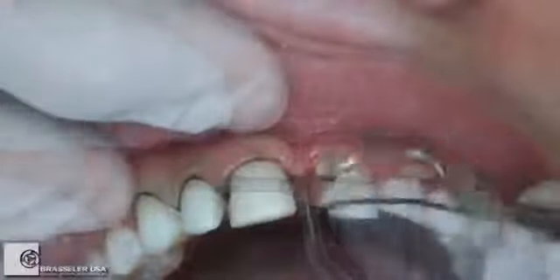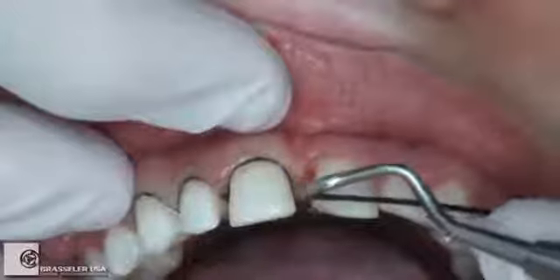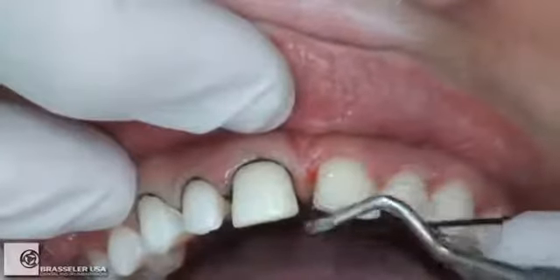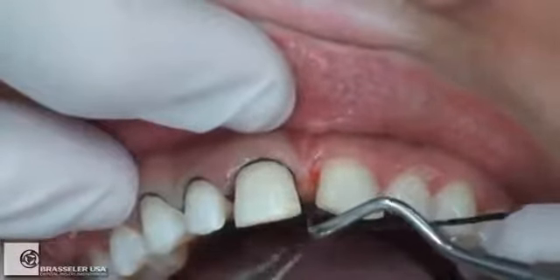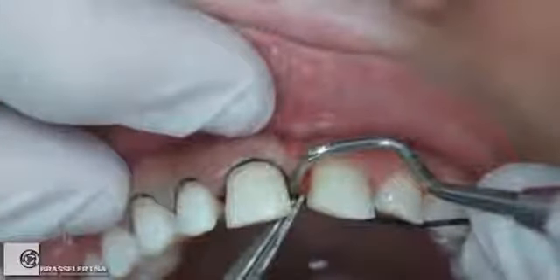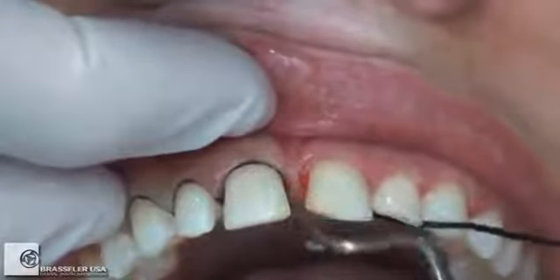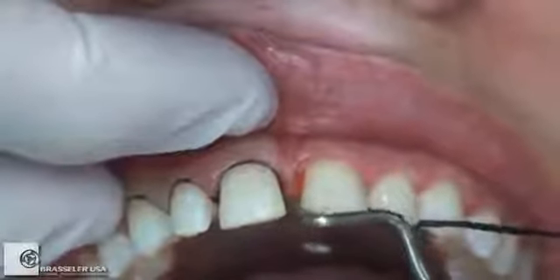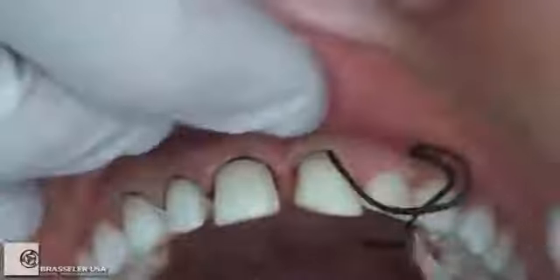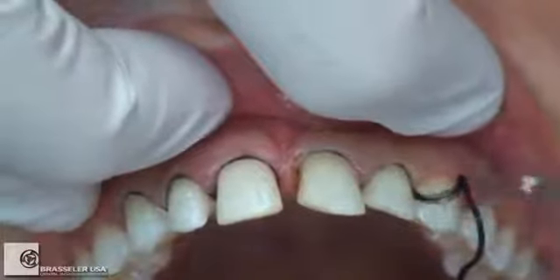Well, I'm going to go ahead and do some sort of tissue retraction. I still like cord. There are other techniques, certainly lasers, Expasyl, things like that, that I'll use on the right type of case. But if we're doing multiple teeth, I still like cord. I'm going to put 000 into the sulcus, and this is before I finish the margin. And I'm not going to drop the margin down anymore. When I come back to finish this, I know where I need my margin line now.